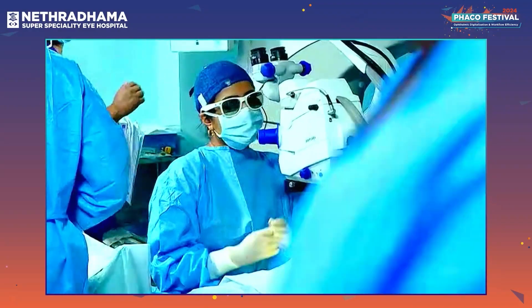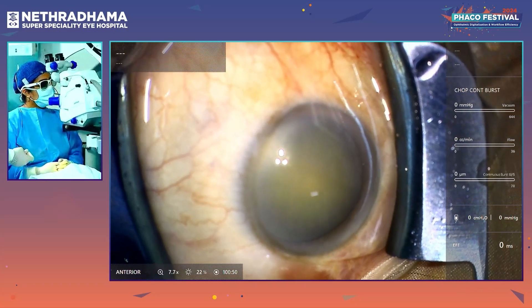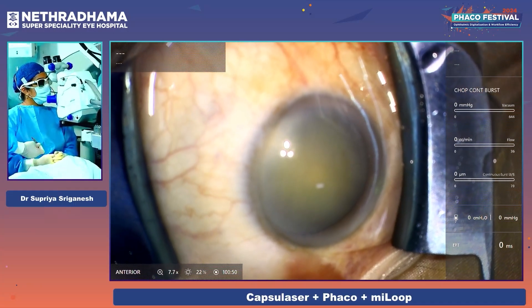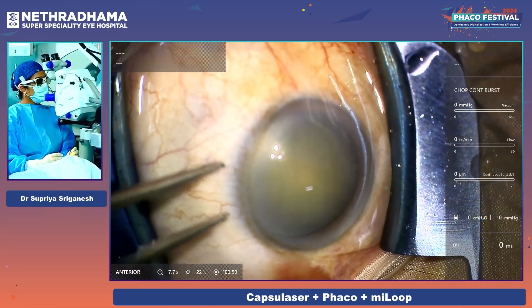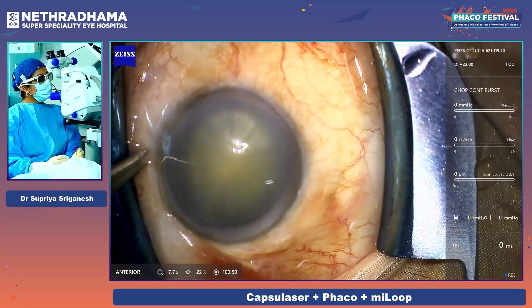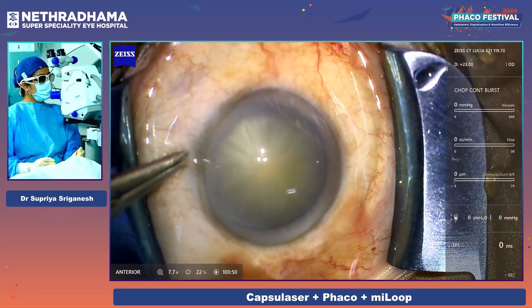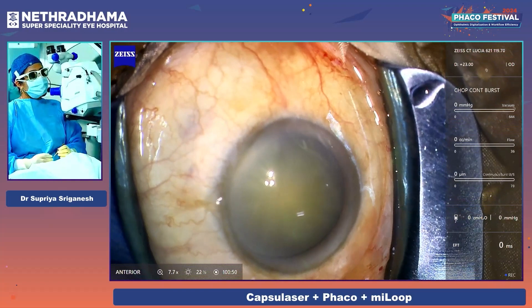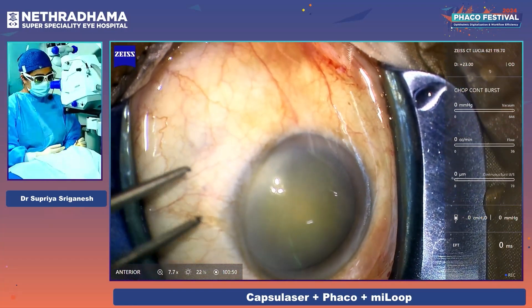This is a mature intumescent cataract and a sub-Tenon's block has been given for this case. I'm just going to try and get the eye into position. I'm using the full surgical cockpit from Carl Zeiss Meditec — the Quatera 700, the ARTEVO 800, the Callisto system. I'm wearing my 3D glasses as you can see.